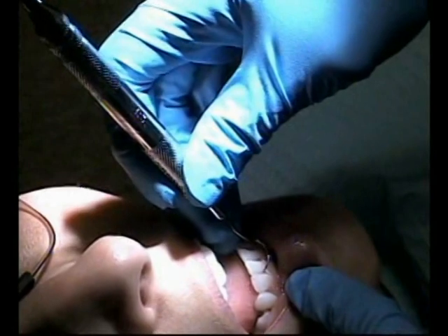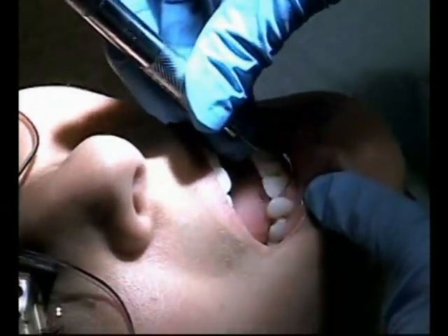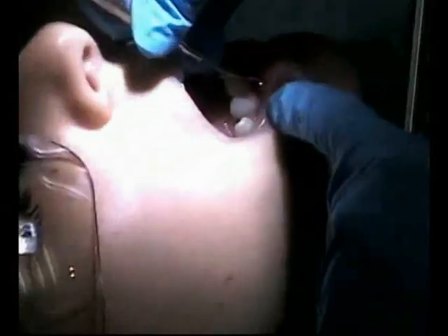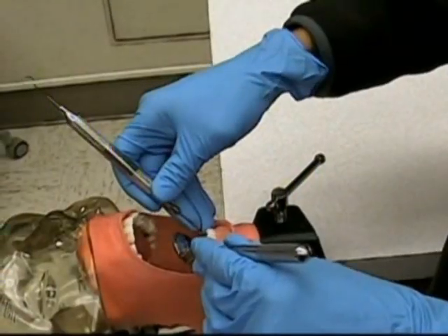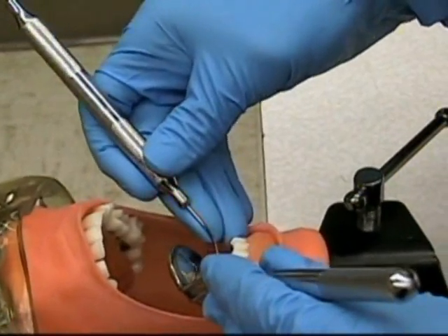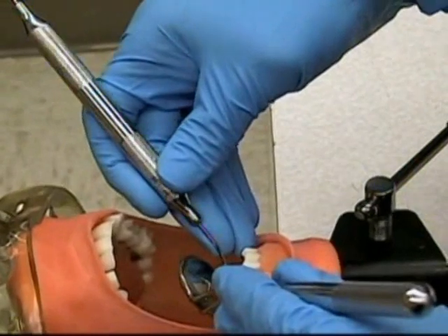All surfaces towards you are worked on from the front of the patient. Surfaces away from you from the back of the patient. Turn away from me, please. Lead with the tip, not the point. Rolling interproximally. Rock the wrist.